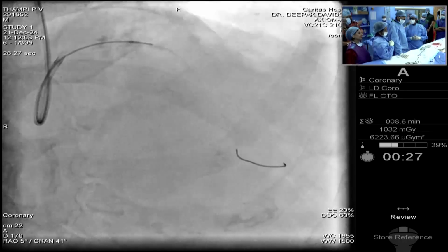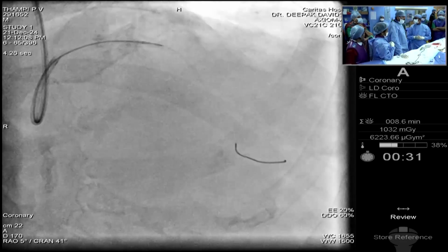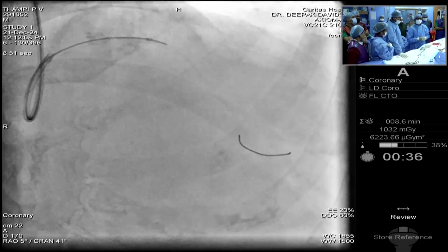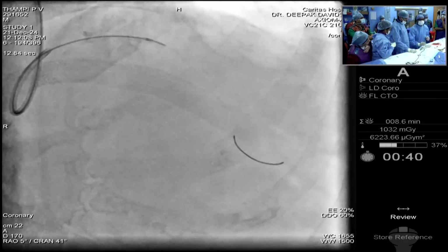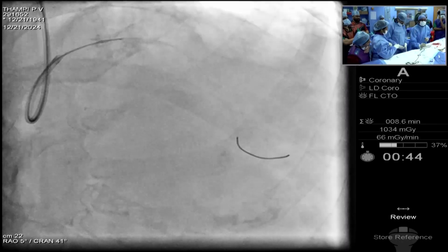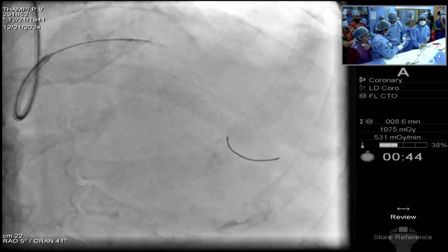You wouldn't want to have too much heat energy created there. Regarding rota, even though they say you can do 20 seconds, we are very meticulous that we never do more than 15 seconds with rota. And even the waiting period with rota, they say you just have to wait for 30 seconds. We always meticulously wait for 1 minute before the second burring.